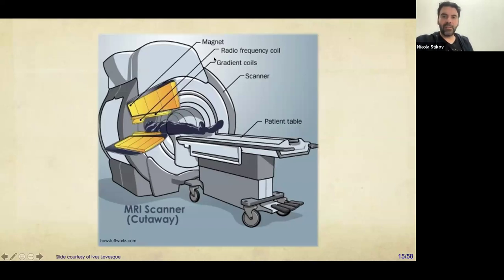But then there are other magnetic fields. In particular, there's something called gradient coils, and those are on the inside of the bore. So you have the big magnet on the outside, and then on the inside, you have the gradient coils. Those are not very strong. They change the field just a little bit, and they're kind of like speaker coils. They're just tightly wound coils that vibrate when you change electricity through them. And that's why, for anybody that's had an MRI, you hear this sound of metal grinding on each other. It's basically loudspeakers that produce sounds as the current oscillates through them.